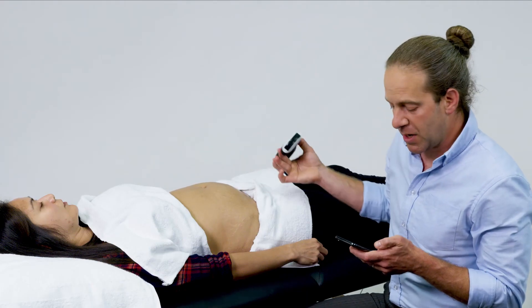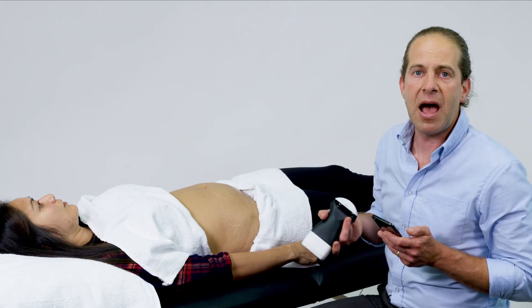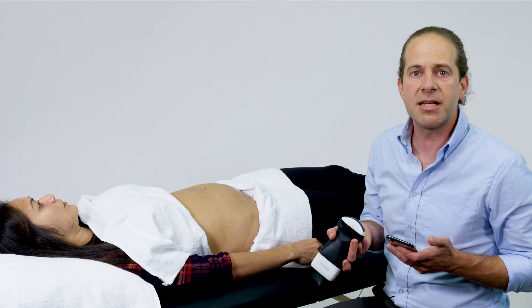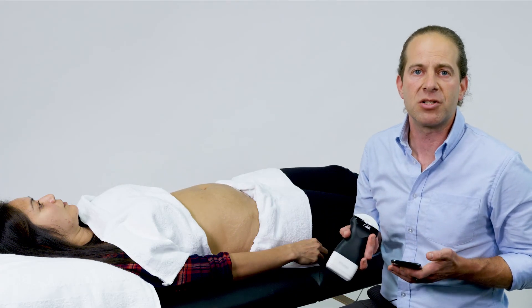I'll repeat the measurement at least two more times to get an average and feel very confident in my assessment of gestational age in the first trimester.